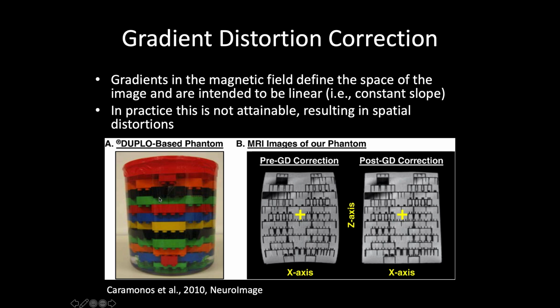It's like big Lego. And what's really nice is you can see that it's shifted the shape. It's kind of pulled it out a little bit. And the idea behind having some sort of a gradient map that you can then use within the software is it helps with correcting the gradients so that now we're looking a little more like Duplo, and that hasn't been stepped on, I guess.